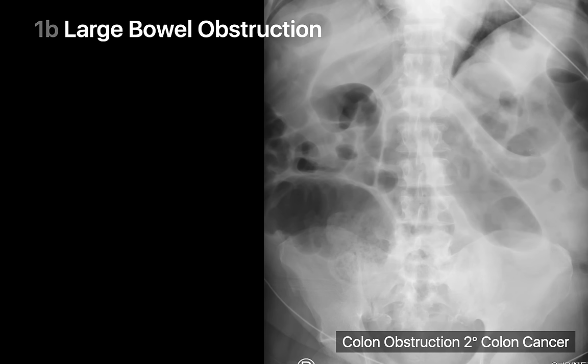In this case of a large bowel obstruction, there are multiple segments of dilated air-filled colon and small bowel in the abdomen, but no bowel gas within the sigmoid colon and rectum.